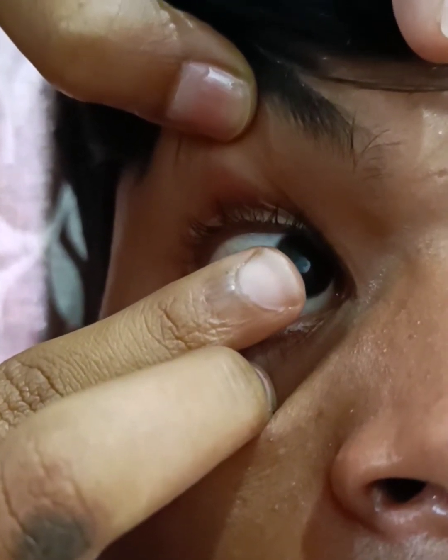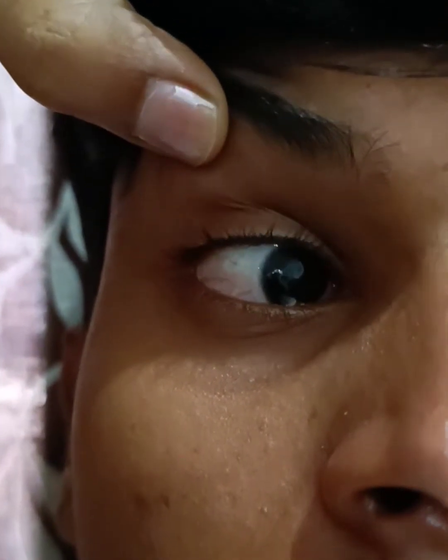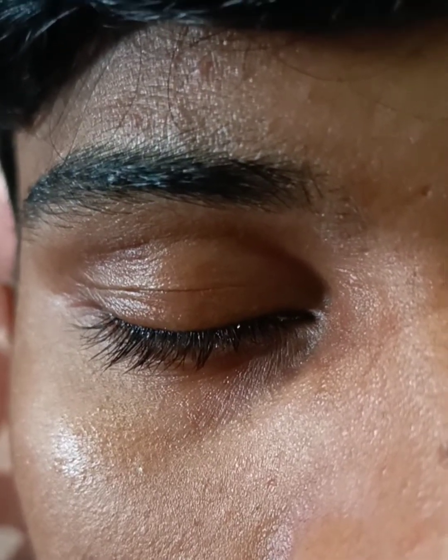Once you place it at the center, tell the patient to look on the lateral side and then again to the nasal side, close the eye and then open. At that time you can see whether the contact lens has landed on the eye correctly.